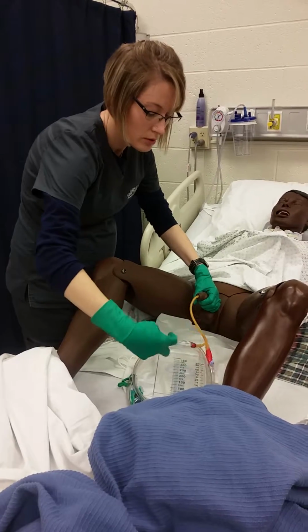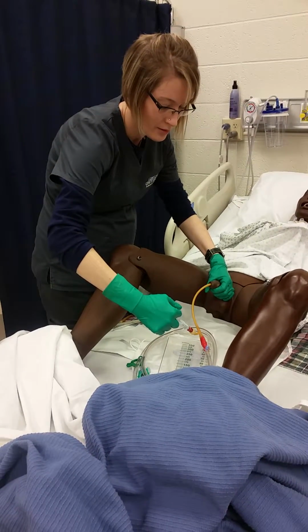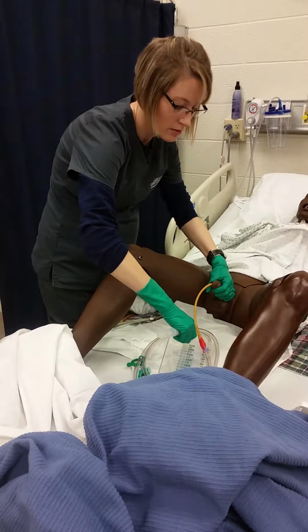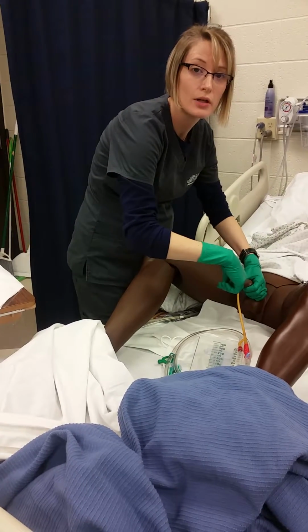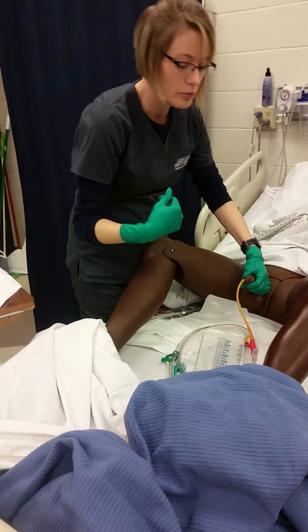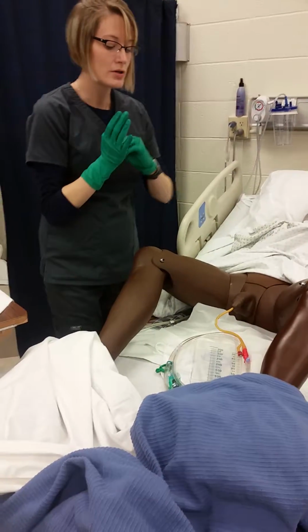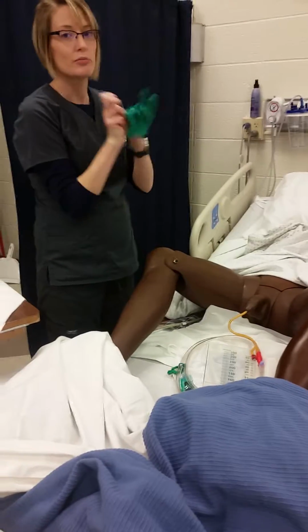And then I will take my sterile hand. I'm going to inflate his balloon and then take off the syringe. And I would tug on this to make sure that it's secure and it's in the right spot. At this point, I can release my hand. I'm going to take off my sterile gloves and throw them away.